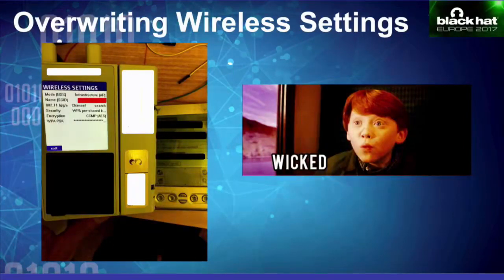So instead of taking their configuration to our device, we configured our device and then took that configuration and cloned it onto the infusion pump. And it overwrote all the wireless settings and network settings of the infusion pump from the PDA. So now we were all good. At this point of time, it simply connected, and that worked. So now we had this infusion pump connected to our lab network.